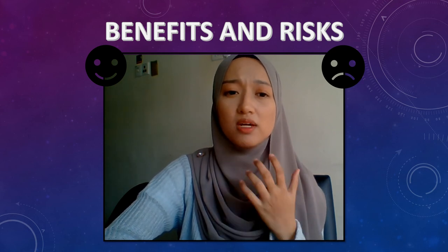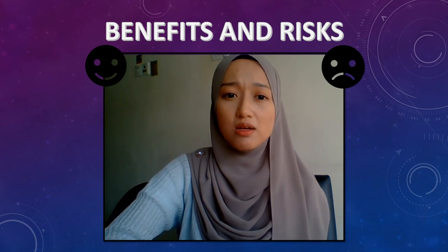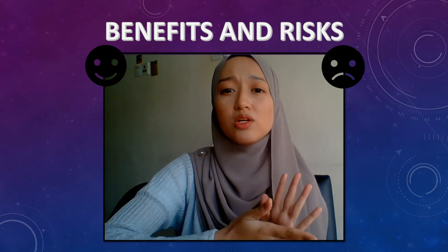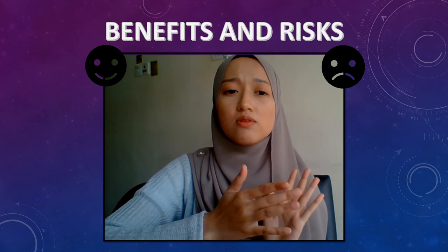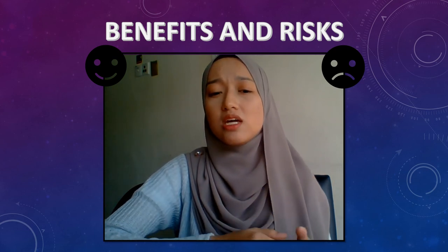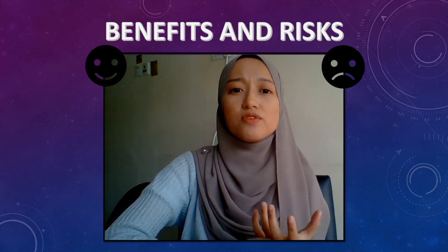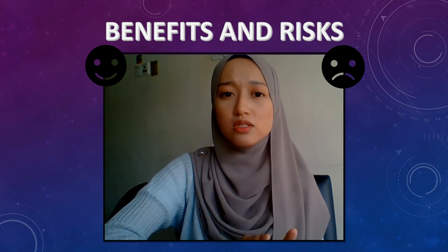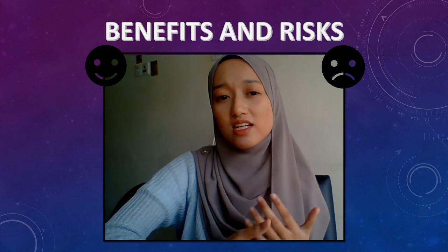As with any medical procedure, spinal angiography has risks. Complications are rare, but may include an allergic reaction to the dye, catheter-related problems, stroke caused by blood clots around the catheter tip or catheter-related vessel wall injury, and also delayed bleeding at the catheter insertion site after the procedure. While the risk of these complications is low and very rare, it's important to have a discussion with your doctor to cover all the benefits and risks that may apply specifically to you.